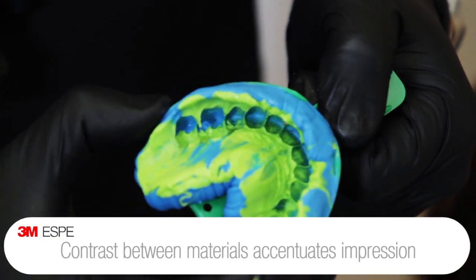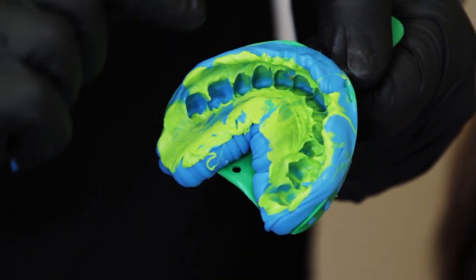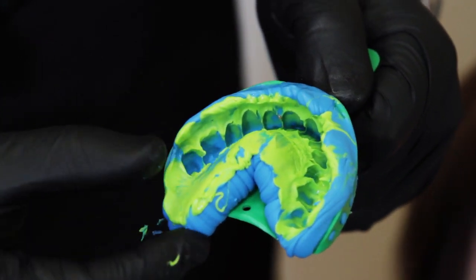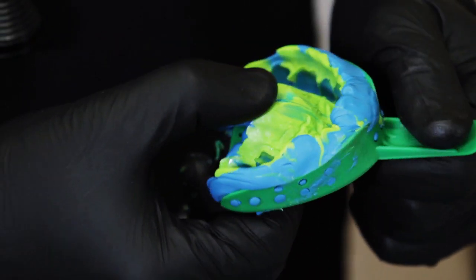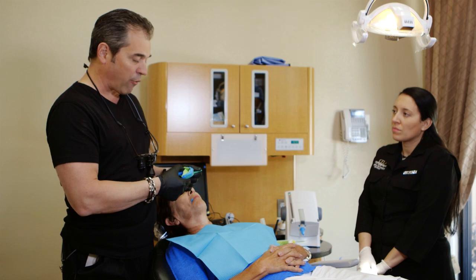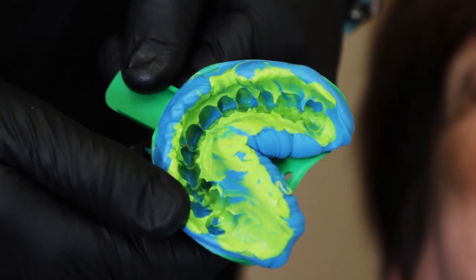If you were to focus in on here, you can see the accuracy. We look at every area, every gingival margin picked up really nicely. And this to me is a fantastic high quality impression that I'm happy to send to any laboratory in the country and expect nothing but greatness coming out of them. So very, very happy with what I see here.